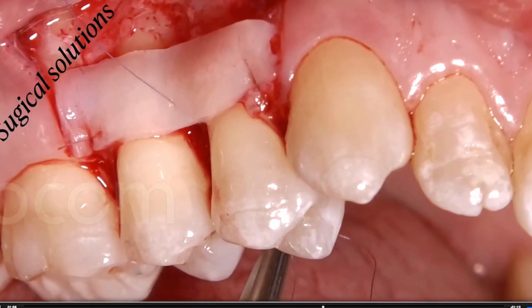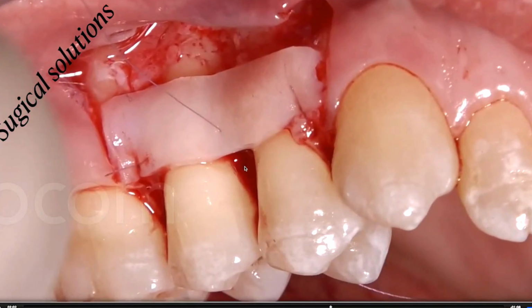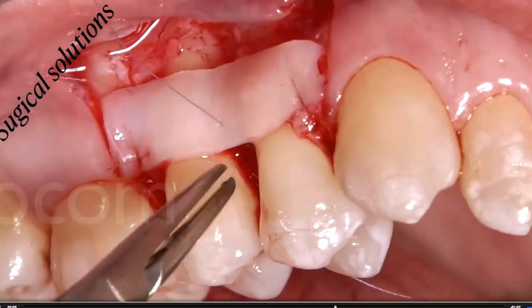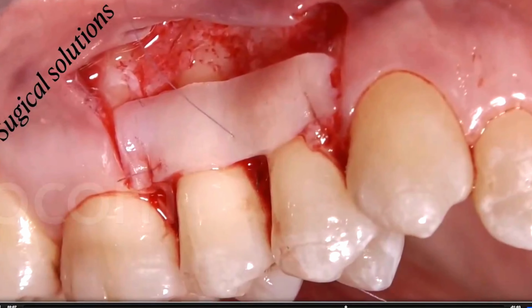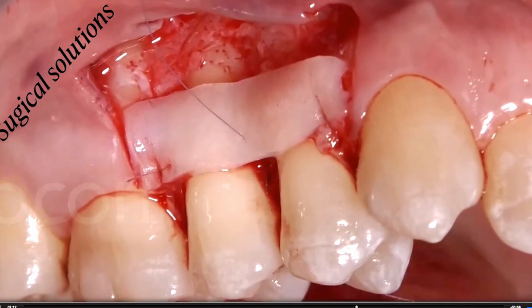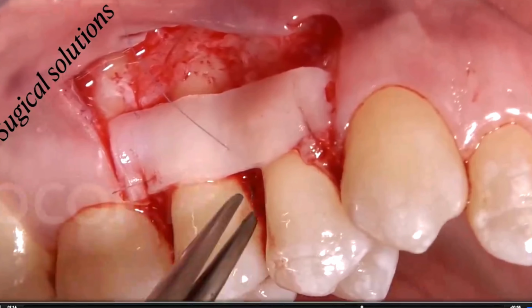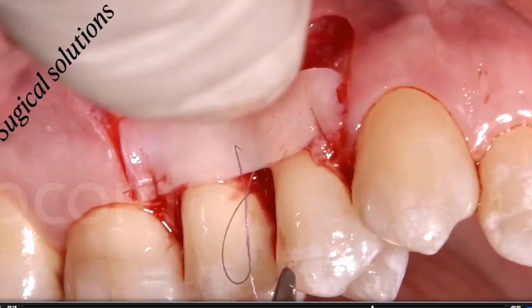So I perforate the palatal aspect. I have to see the needle getting out here just coronal to the graft, and now close the surgical knot so you don't risk displacing your connective tissue graft too much coronally in this papilla that is so weak, so palatally displaced, that it doesn't allow you to place the graft more coronal than this.